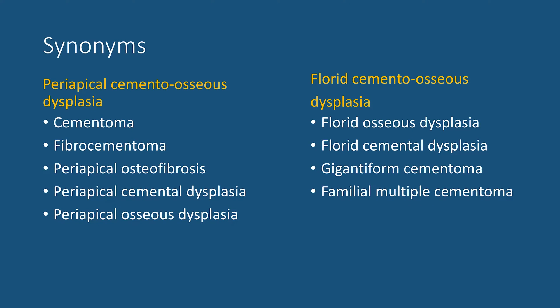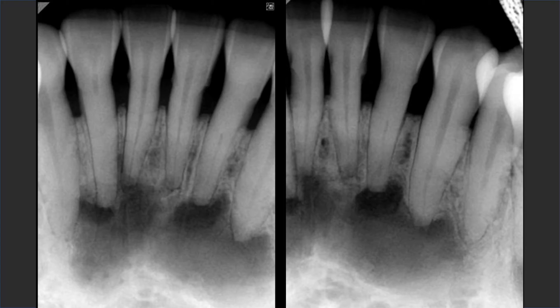In addition to the classification, this condition has had different names over the years, but these names have minimal consequence or impact on patient care. Currently the preferred names are periapical cementoosseous dysplasia and florid cementoosseous dysplasia. On our periapical radiographs we saw multiple radiolucent areas, probably continuous, around the apices of the mandibular incisors.